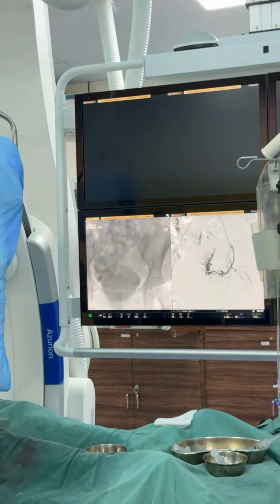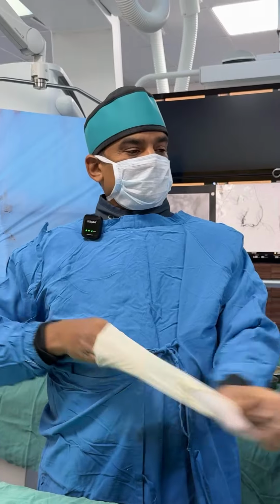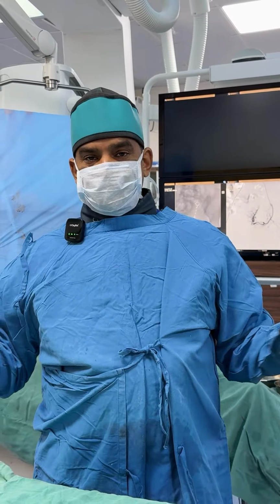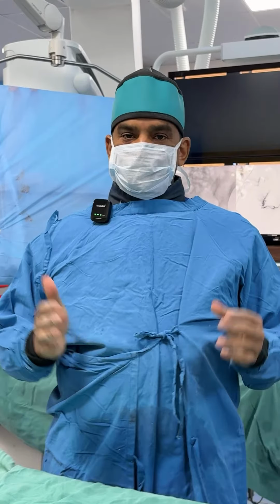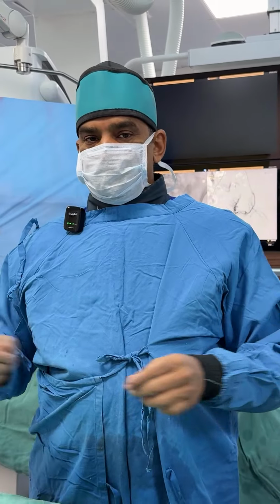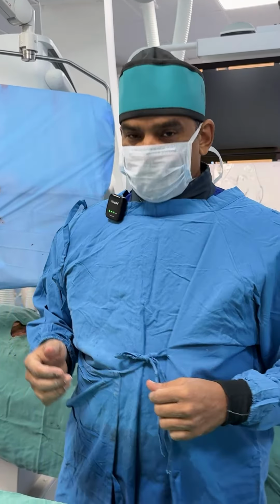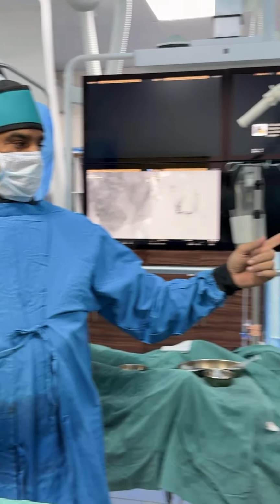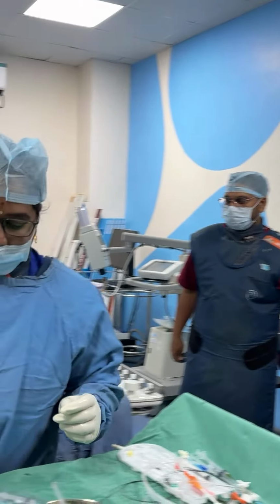Thank you so much. So we just finished the uterine artery embolization for this lady who is 52, having massive per vaginal bleed and having a heart failure, not suitable for any kind of anesthesia. It was done under local anesthesia from a single puncture in the groin, and the puncture will be closed with a Perclose. So everything is fantastic. Tomorrow the patient goes home. Thank you so much. And from our team, Parvati, Prasad, Gauri, and Stalisin. Thank you so much.